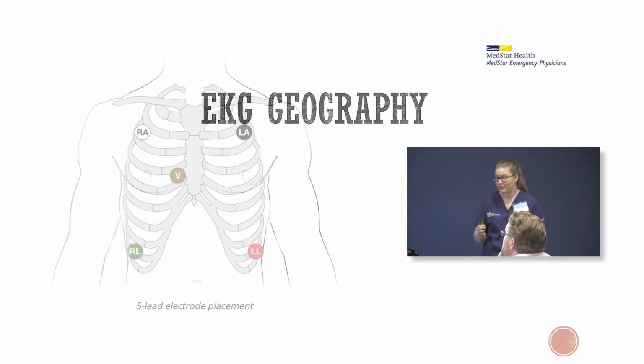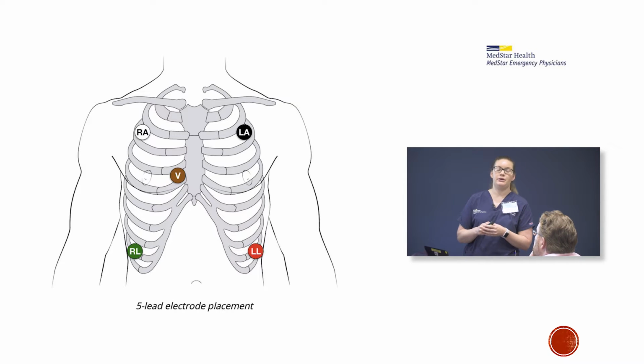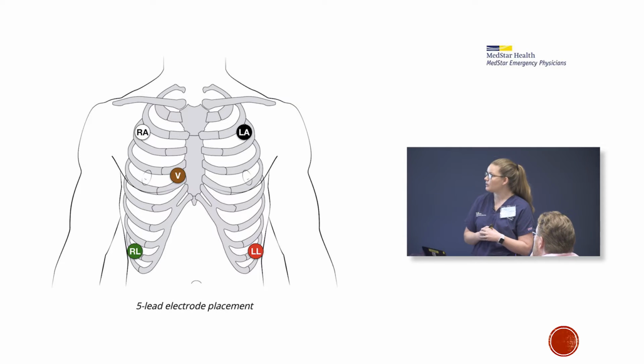So geography, how many of you guys put your own leads on? No one. So the only reason this is important to know for specific EKGs, such as right-sided EKGs or posterior EKGs, it's helpful to know where to put the leads. Because a lot of times your staff won't know, so it's good to be able to give that direction.